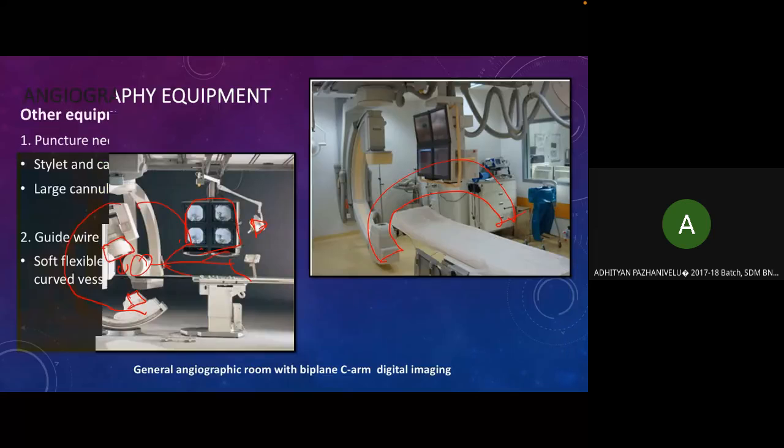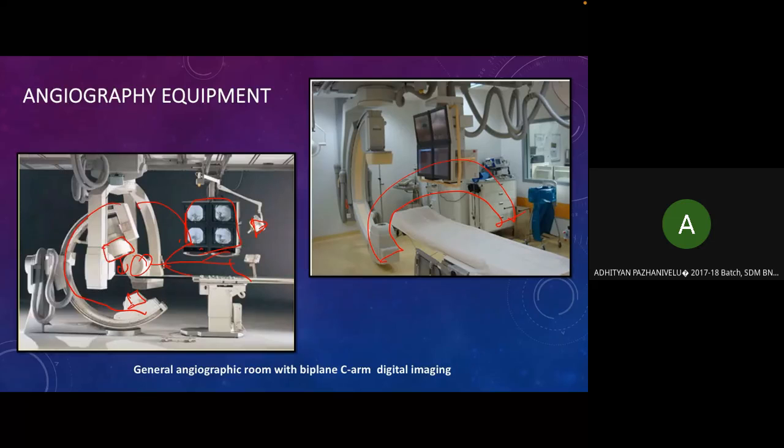Suppose I am taking my patient to do an angiogram, and I want to do an angiogram on Mr. Ramesh. Can I be standing there simply while he is undergoing it, or should I take some protective measure for myself?